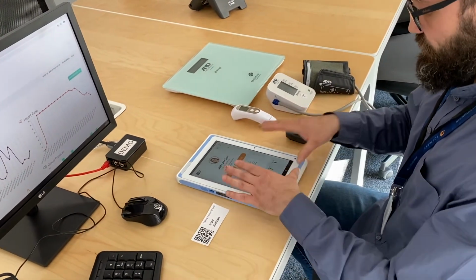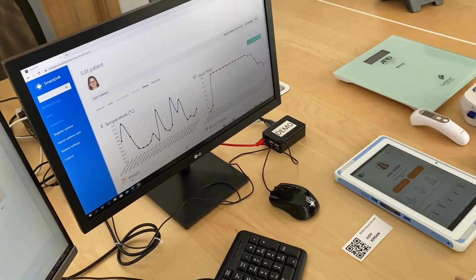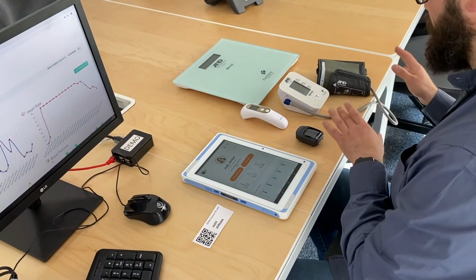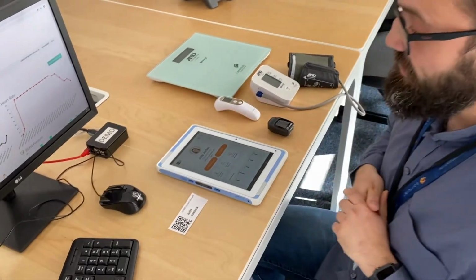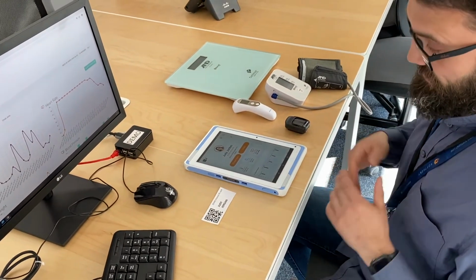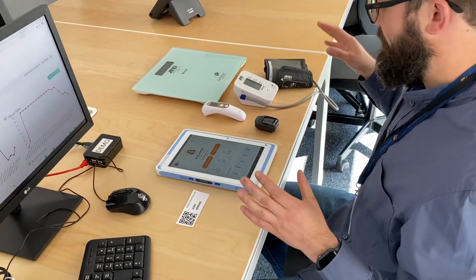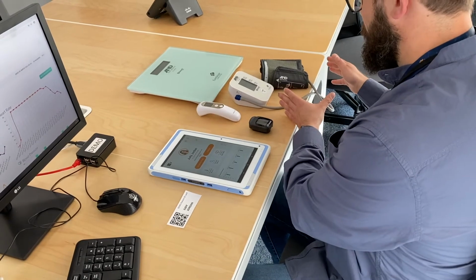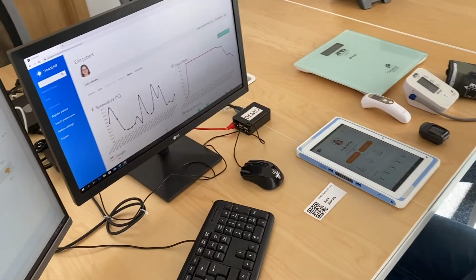The data that you see on the tablet is also saved in the electronic health record system. So with the solution, we're eliminating all of the human errors. All of the right readings are sent directly into the electronic health record system. So medical personnel can have a judgment on these results based on their experience, and all of that is trusted and secured. Patients' data are secured from the moment when the measurement is taken all the way up to the electronic health record system.